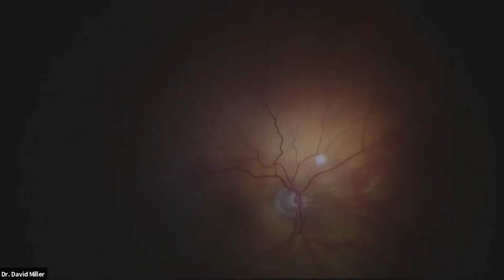For the most part, those little retinal tears you just saw me cauterize don't have much traction on them at all. It's not going to take months to reattach itself. The retina wants to be against the back of the eye. So you don't have to get off every little piece of vitreous around a tear site to make for a successful surgery.